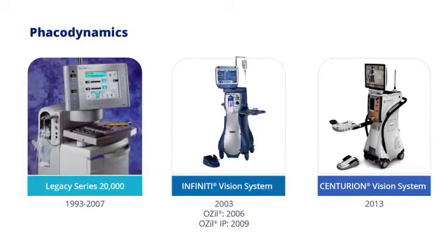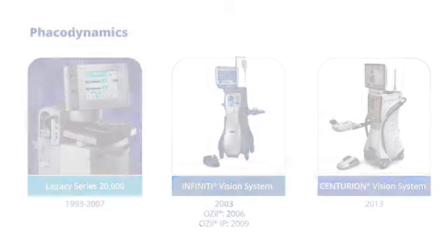Phaco machines have evolved over the last decades to provide unprecedented stability to the anterior chamber during cataract surgery. Fluidics are extremely important during nuclear disassembly, where we aim to remove the nucleus whilst protecting the corneal endothelial cells and posterior capsule. Understanding the physical principles driving this technology of phaco allows us to optimise machine settings and safely avoid or manage problems as they are encountered during surgery.